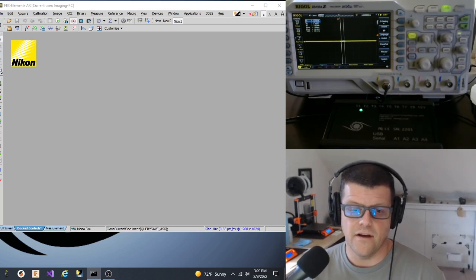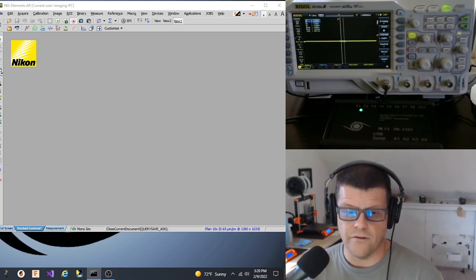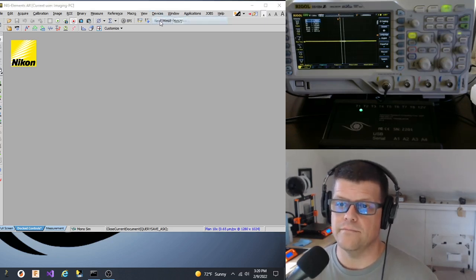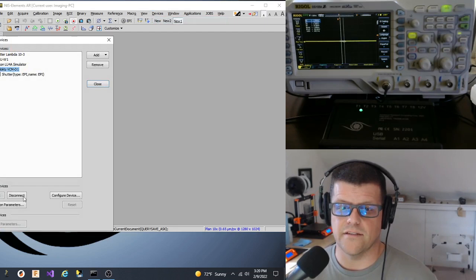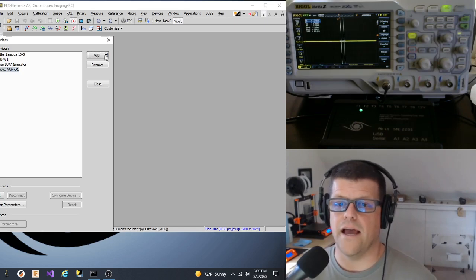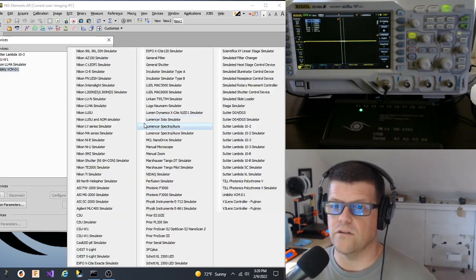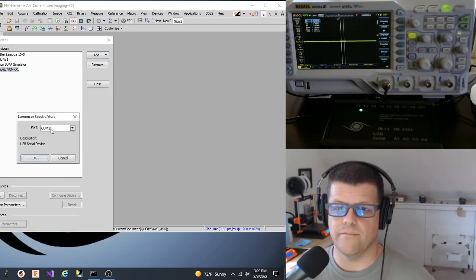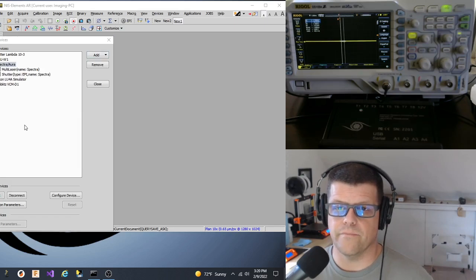And then I'll go to my other driver, activate that. And now, if we disconnect this device and then connect up, let's see here. Do we have this device added? Guess we don't. So we'll go ahead and turn it on. That's going to be the Spectra Aura. So once this turns on, we'll put it on our COM port. All right. And away we go.